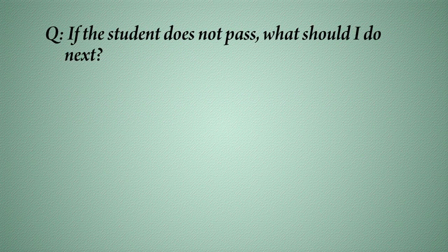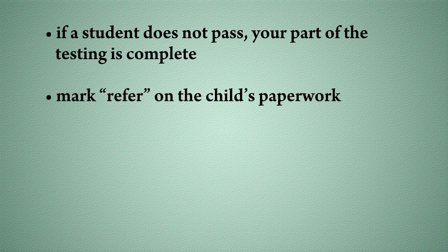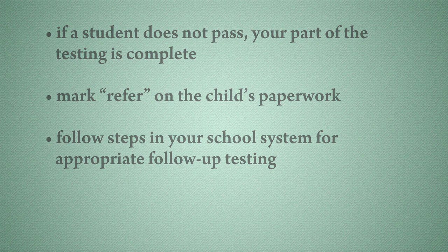If the student does not pass, what do I do next? If a student does not pass the screening, your part of the testing is complete. However, your responsibility is not over. It is important that you mark refer on the child's paperwork and that you follow the steps that are set up in your school system so that the child receives the appropriate follow-up testing.